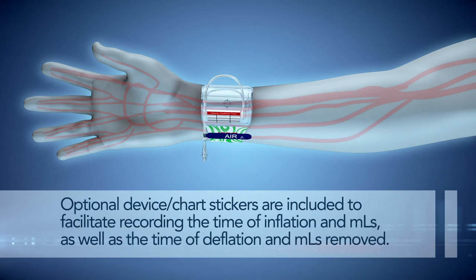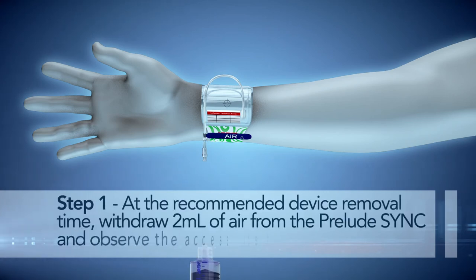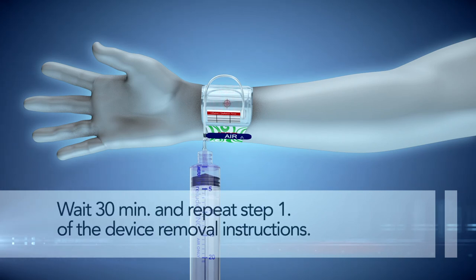Optional device chart stickers are included to facilitate recording the time of inflation and milliliters, as well as the time of deflation and milliliters removed. Device Removal Step 1: at the recommended device removal time, withdraw 2 ml of air from the Prelude Sink and observe the access site for bleeding. If bleeding is present, inject air until bleeding stops. Wait 30 minutes and repeat Step 1 of the device removal instructions.